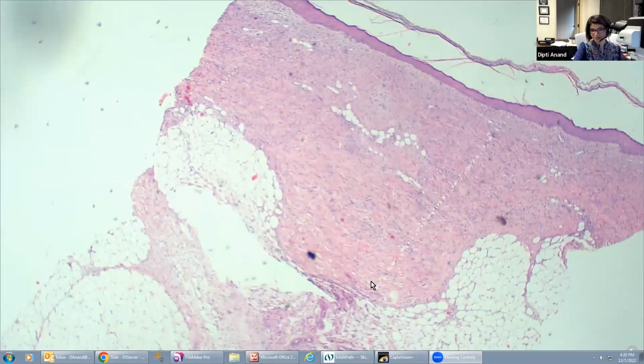And all these fibroblasts tend to be CD34 positive. So CD34 staining is seen in nephrogenic systemic fibrosis and not in scleromyxedema. One of the classic lesions of nephrogenic systemic fibrosis is a lollipop body. The lollipop body, which we don't see in this slide, is in my handouts.